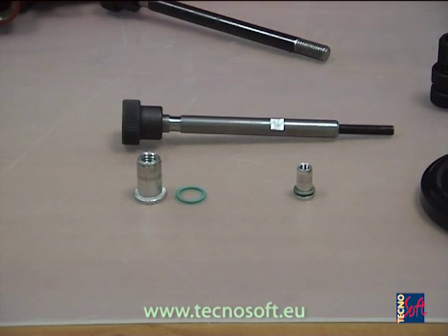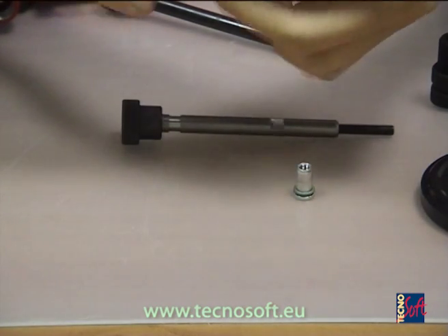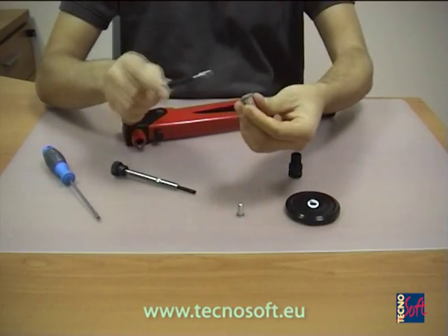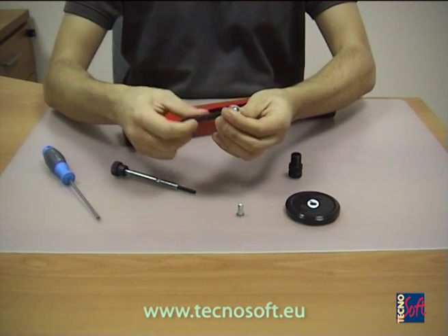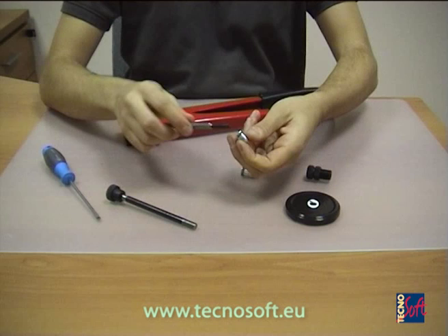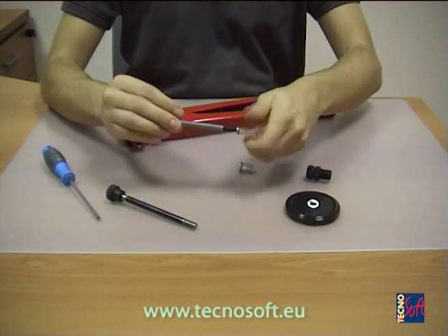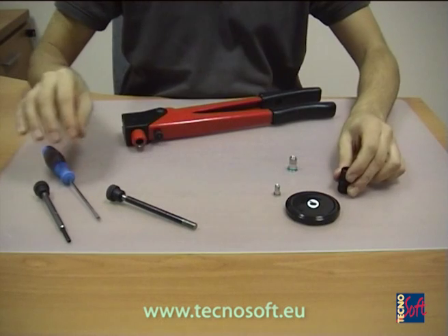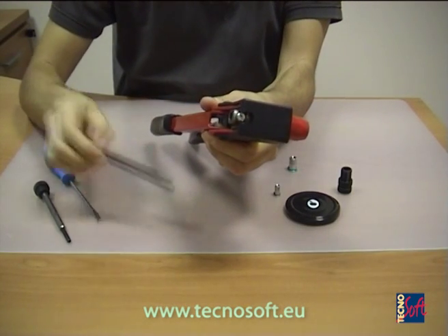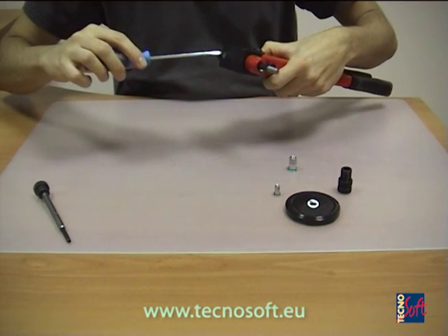First of all, prepare the rivets with their proper O-ring. Then take the correct threaded pivot — there are different diameters for the different rivets. Insert it in the top part of the riveting tool, then fix it to the riveting tool by screwing the top screw.